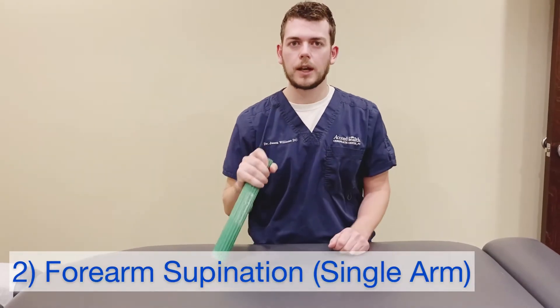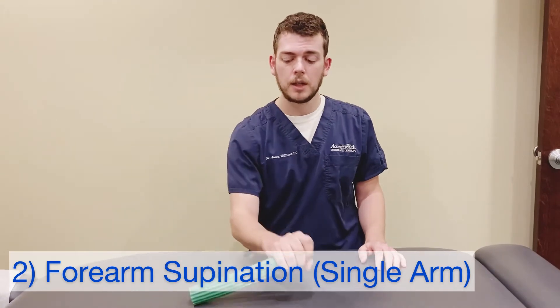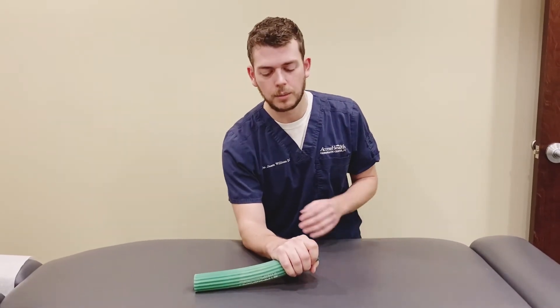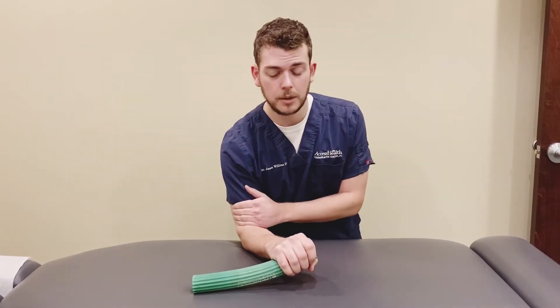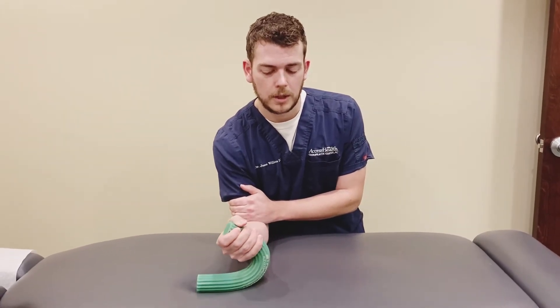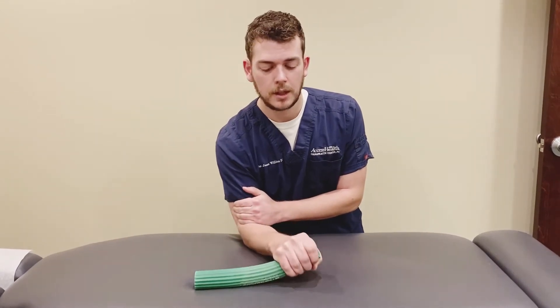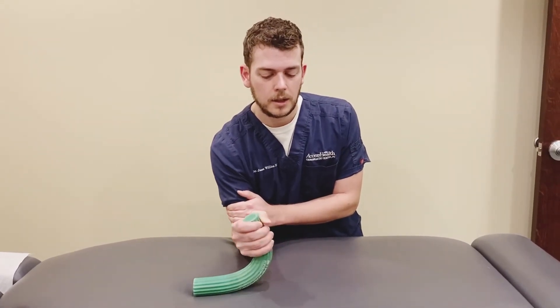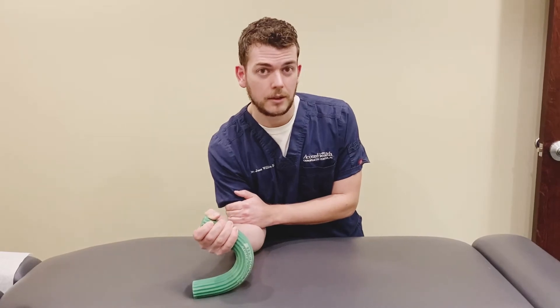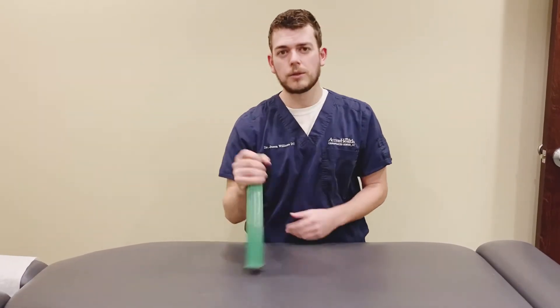To work on the supination part, it's pretty easy — we're just going to flip this around. You're going to start with your palm down towards the table and then roll your wrist up so that your palm is facing up towards the ceiling. Again, nice and slow here. Get a good grip on this — you don't have to death grip it, but get a good grip and go ahead and run through some reps of that.